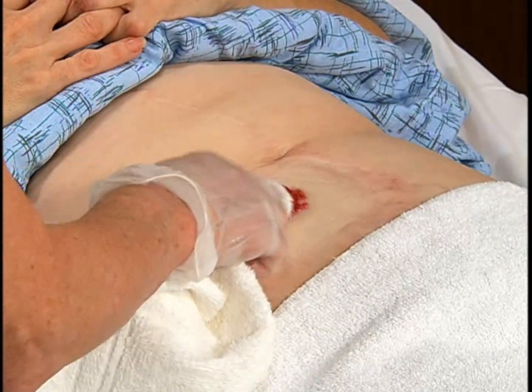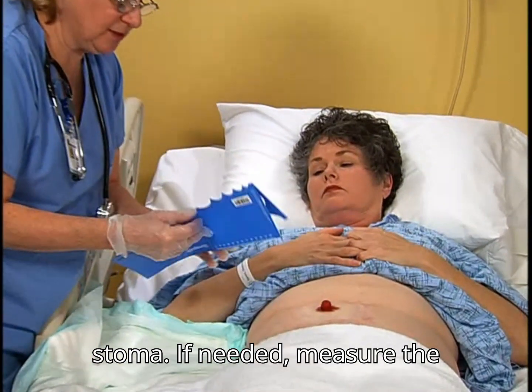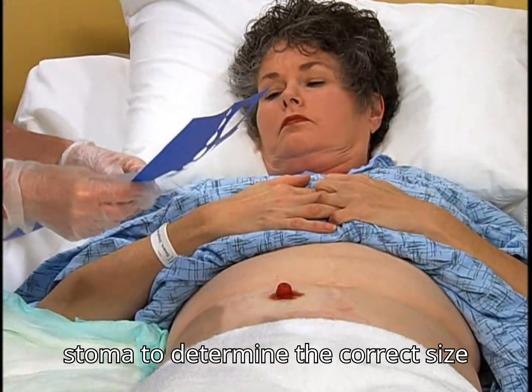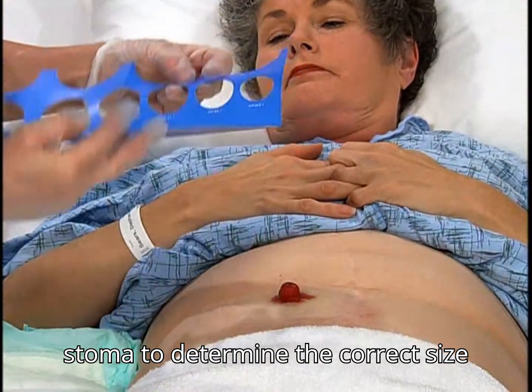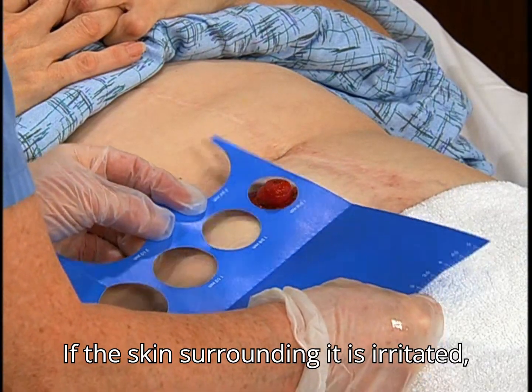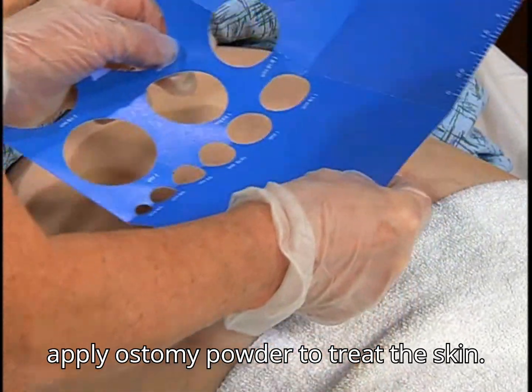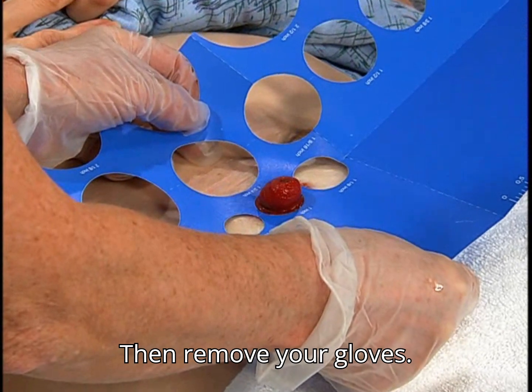If needed, measure the stoma to determine the correct size pouching system to use. If the skin surrounding it is irritated, apply ostomy powder to treat the skin. Then remove your gloves.